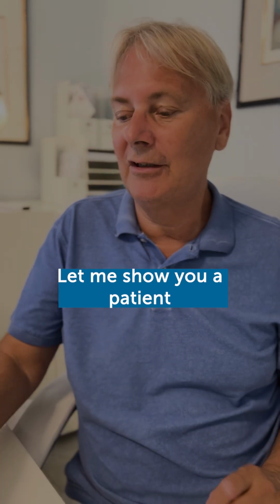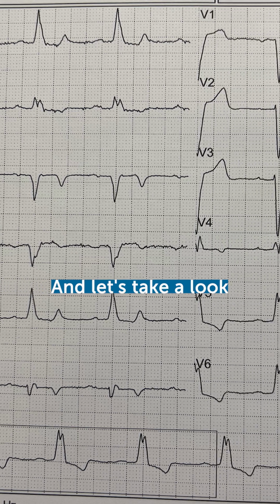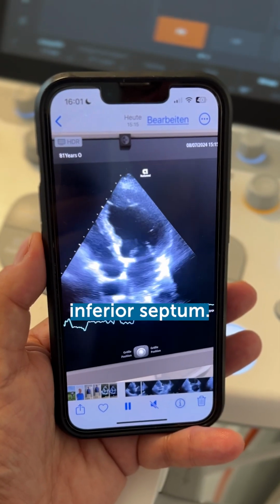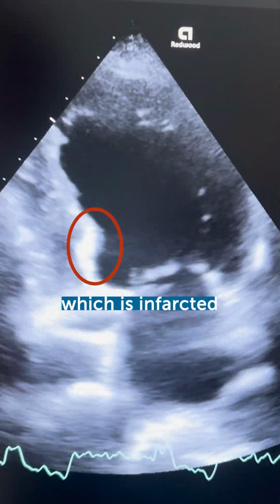Let me show you a patient with an inferior myocardial infarction. This is his ECG. You see he has a left bundle branch block. And let's take a look at how you should image the patient. You need to look at the basal inferior septum, so you tilt downwards. You see this echogenic region right here. This is the basal inferior septum, which is infarcted.